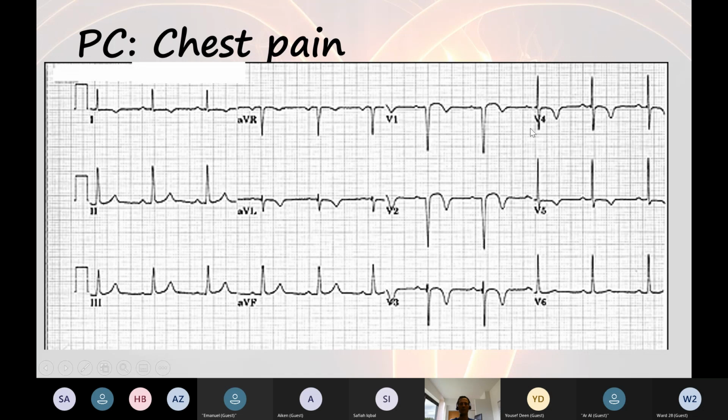So find out when the pain happened. If this patient had severe dyspepsia a week ago that they just took some Gaviscon and went to bed with, then that could have been a big infarct happening a week ago. Or this could have happened 10 years ago. You can't tell how old it is from the ECG.